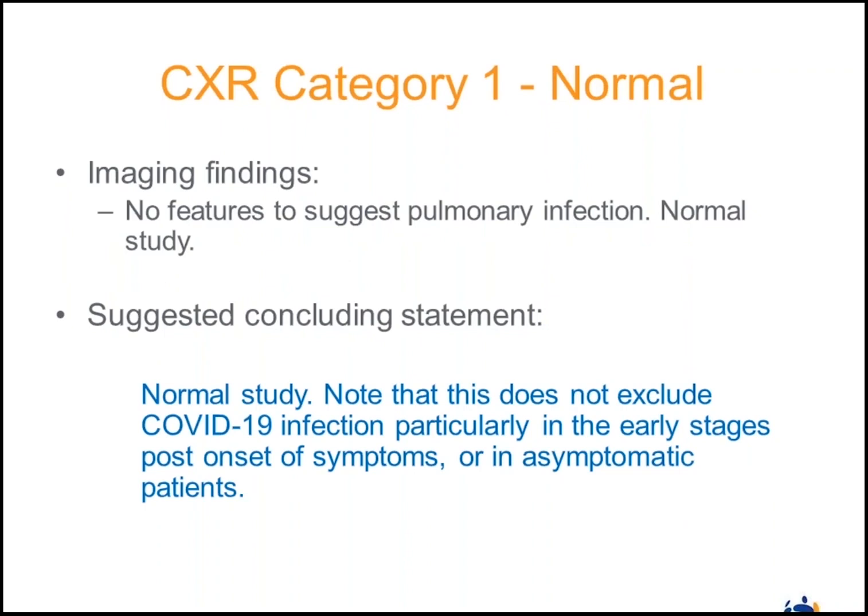So the normal category, it looks normal. You can't say that the patient isn't infected, particularly in the early stages of disease.